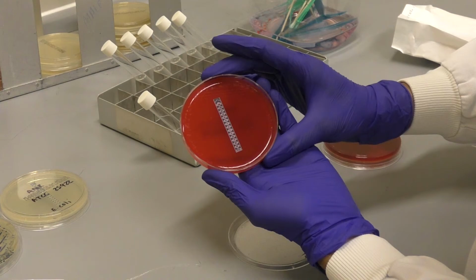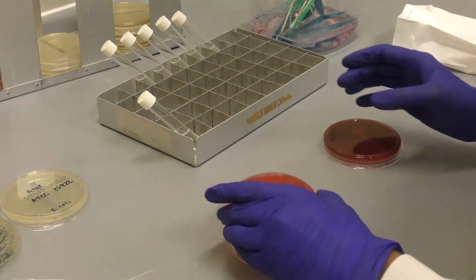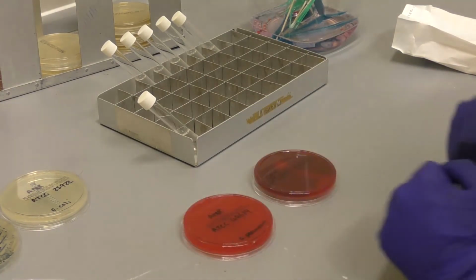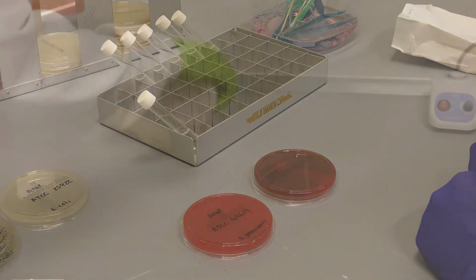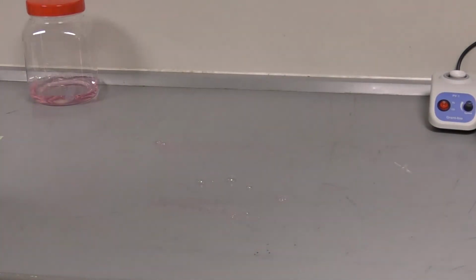Once the strip is applied, incubate the plates in an inverted position in stacks no higher than 5 at 34 to 36 degrees C for 16 to 20 hours for E. coli, and 34 to 36 degrees C in a 5% CO2 incubator for 18 to 20 hours for Streptococcus pneumoniae. You will then need to clean down your bench space appropriately.